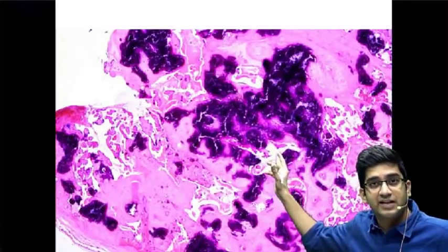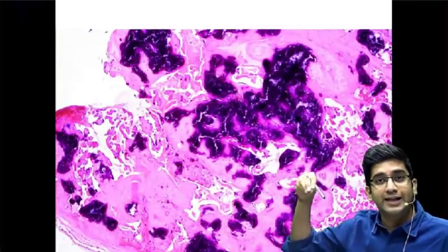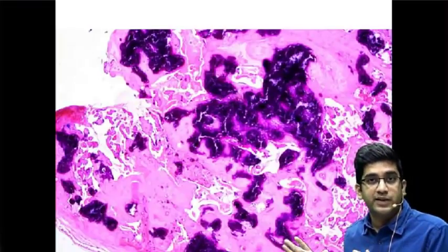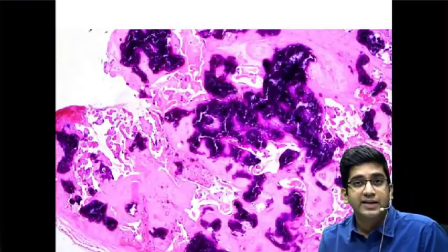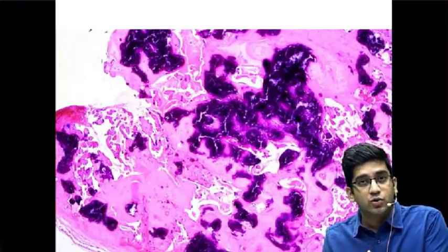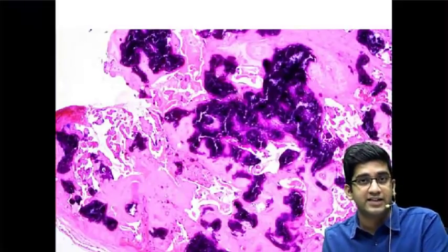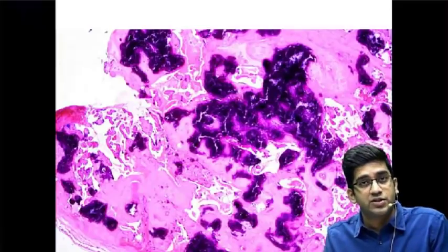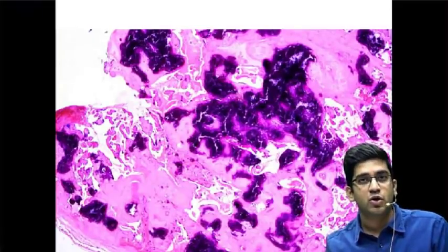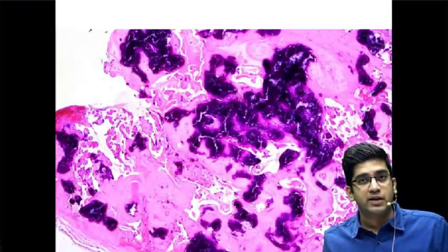Compare this calcification with the comedo necrotic in the center of the duct in case of DCIS. When I zoom this out it will become big - they won't be fine. So when I see a fine calcification in a mammogram, it correlates to the necrotic calcification in case of DCIS. When you see a coarse calcification in a mammogram, it's going to correlate to a benign lesion. This is the simplification of how what I'm going to see in microscopy is going to reflect in the mammogram.